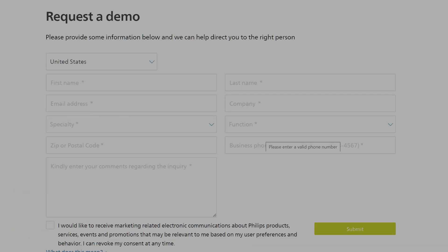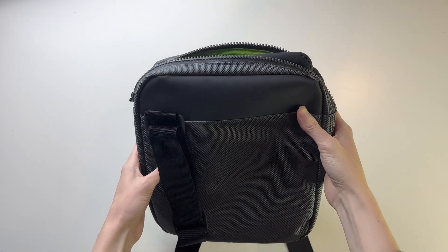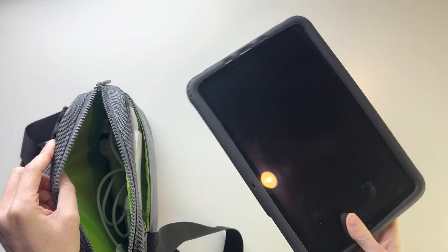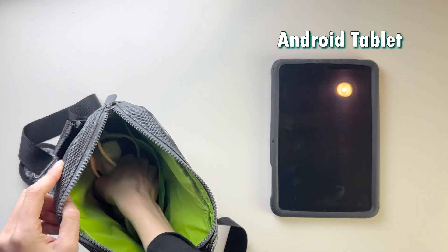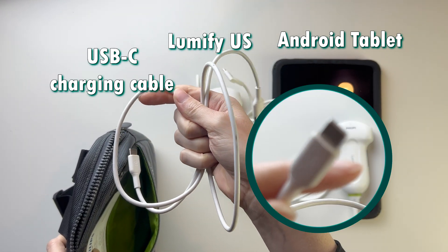Having chosen the C5, I requested a demo, put in my information, and before I knew it, it was here. It came in a nice quality bag with a strap, an Android tablet, the C5 Lumify ultrasound, and a USB-C charging cable.